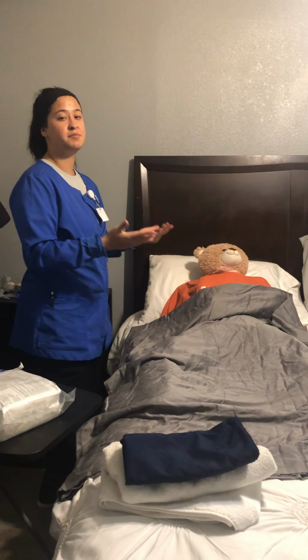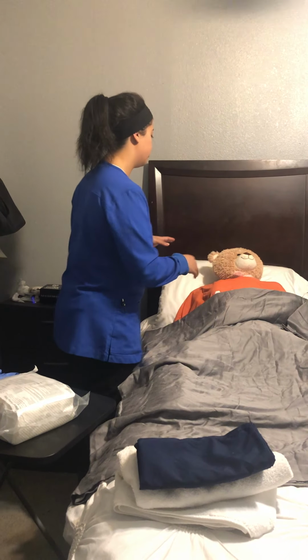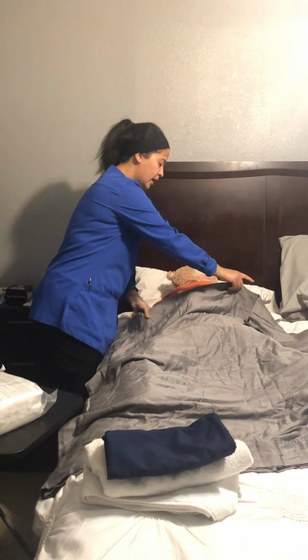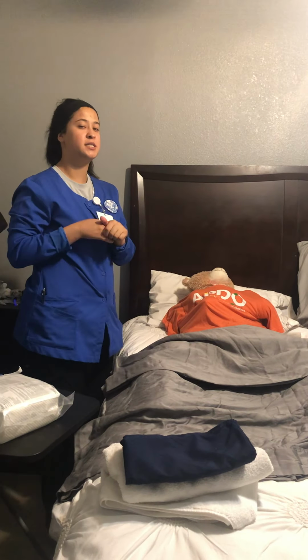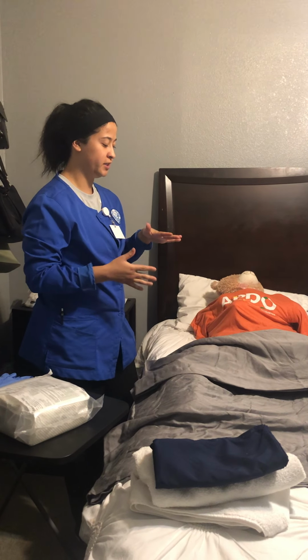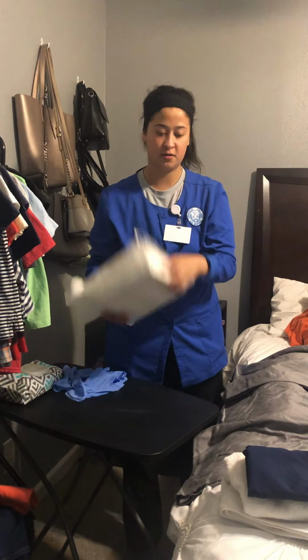No? Okay, I'm then going to raise my patient's bed to a comfortable working level for me. Once I do that, I'm going to remove my patient's pillow and place her in a dorsal position. I'm just going to examine her bladder. I'd either do it with the bladder scan or palpating it. The bladder scan is going to tell me how much fluid is left in the bladder, and just palpating it for any distension. Once I do that, I'm going to get my supplies, get it all together.